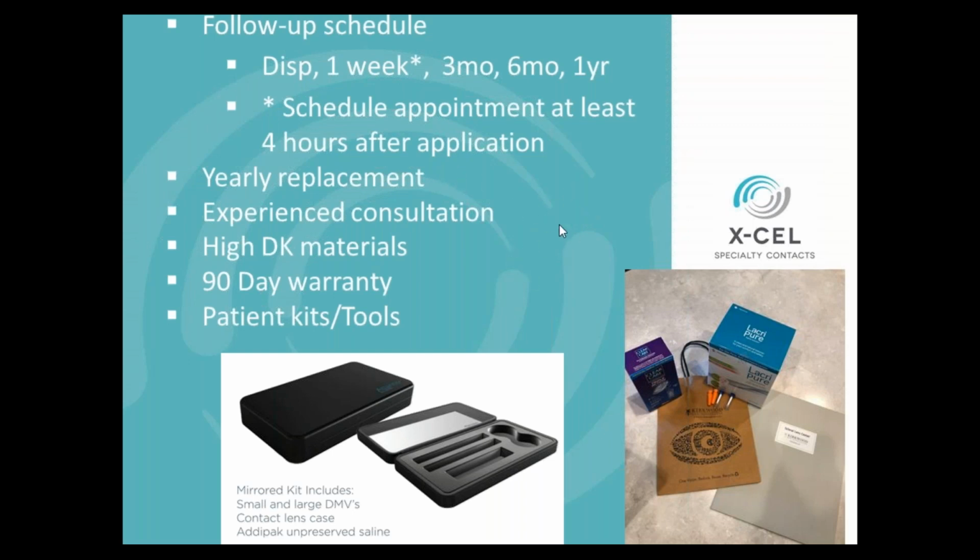Again, all the pre-work and having all the things that you need in the tools at the beginning, but we also feel it's very valuable to send that patient on their way. We know compliance is a lot better when we provide the patients with the care system that they need, the utensils for insertion and removal, and how they can get these in case they're lost or anything that they need. We do provide them, or we want to provide them with the unpreserved saline.